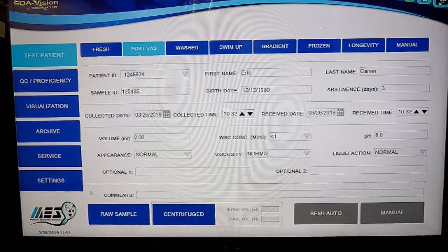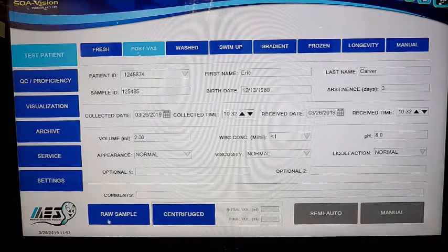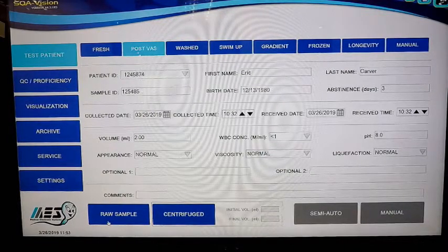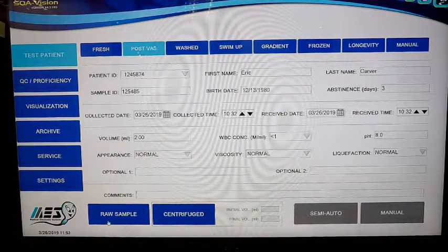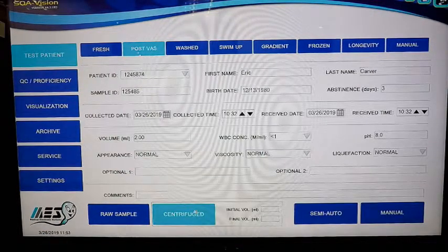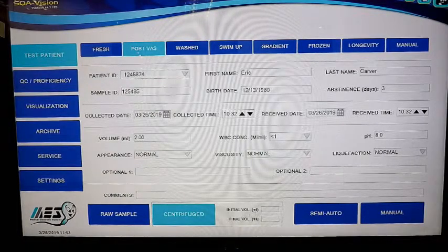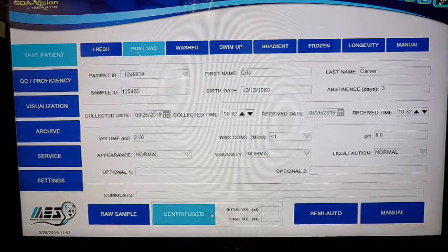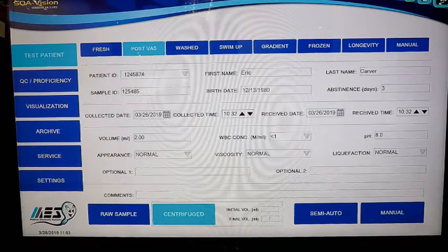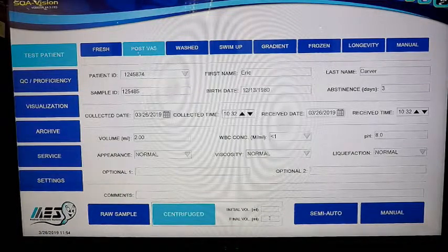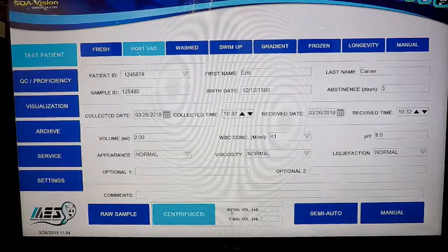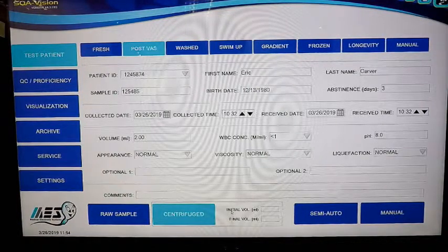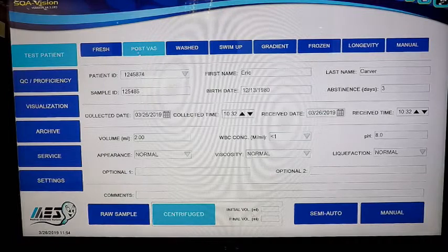Next is the first decision point as to how you want to run your samples. We have the option of running just a regular raw sample, which would be after it's collected, you run it without manipulation. You've also got an option to centrifuge the sample. The system will allow you to put in your initial volume when the sample was collected, and after you spin it down and decant some of the seminal plasma to concentrate it, you can put in your final volume. This allows the system to calculate the actual results in a quantitative fashion based on the original ejaculate. For example, if you're removing half the sample, the results would be 50% of what they would have been, and the system will calculate that automatically.